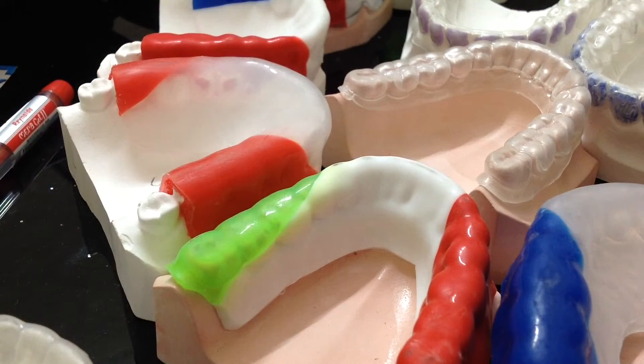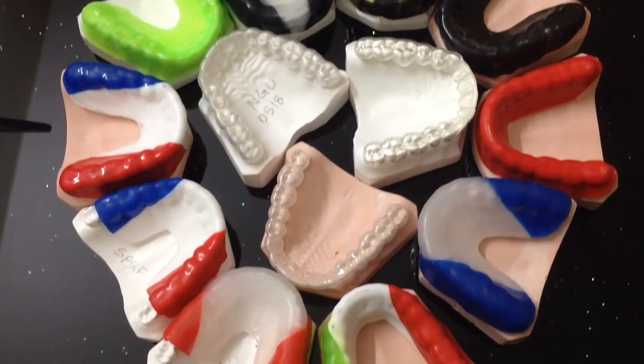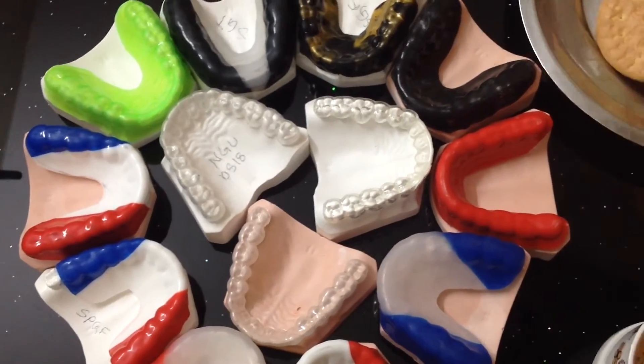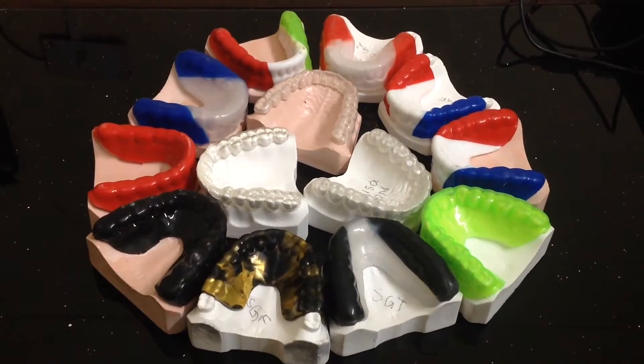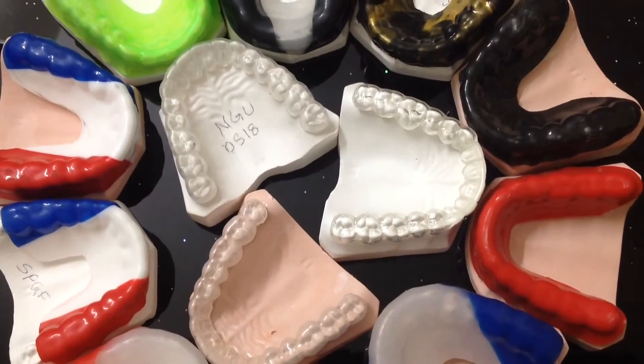We are discussing different types of mouthguards from D.A. Marathon. There are two types of mouthguards. The first type are the bruxous splints, or the night or day guards — these are of the clear type. The second type are the sports mouthguards, which are the colored ones.